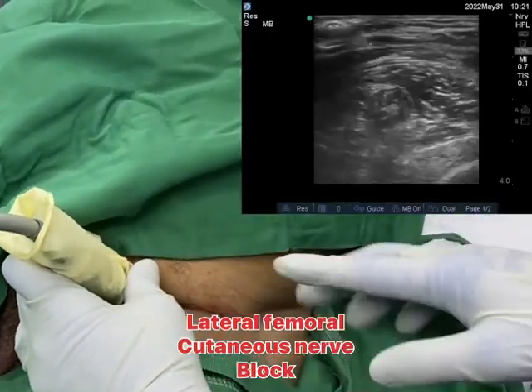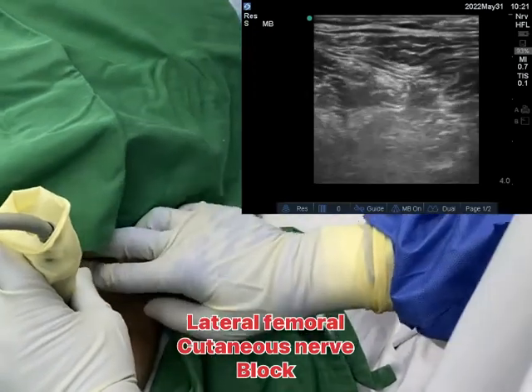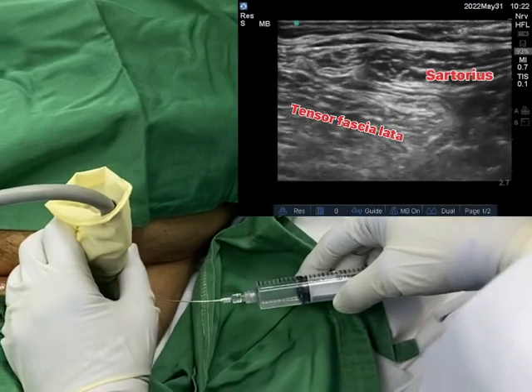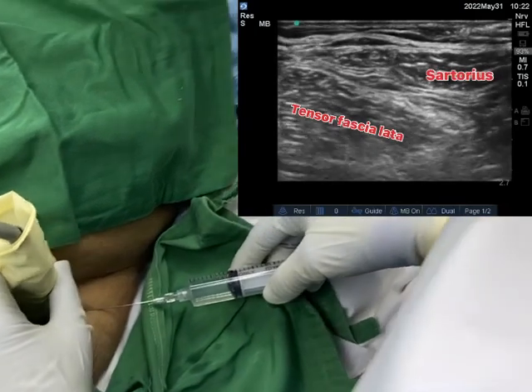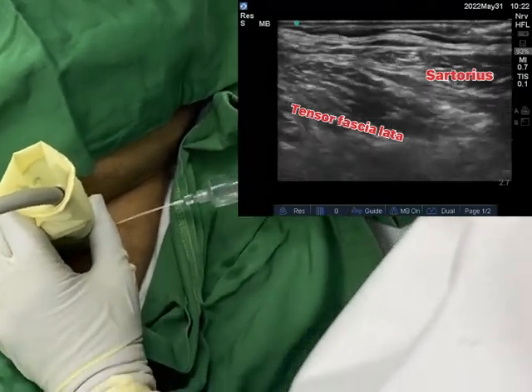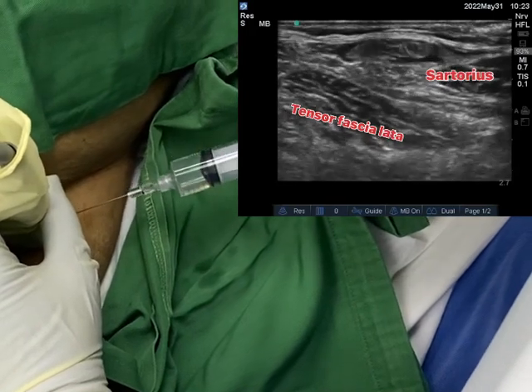For the lateral femoral cutaneous nerve block, we have to slide the probe laterally, still within the femoral crease, until we appreciate the sartorius and the tensor fascia lata muscle. 5cc of local anesthetic is deposited in this area after skin wheal. You may or may not see the nerve, but that's okay. Visualization of local anesthetic spread in that area is enough indicator to block the nerve.